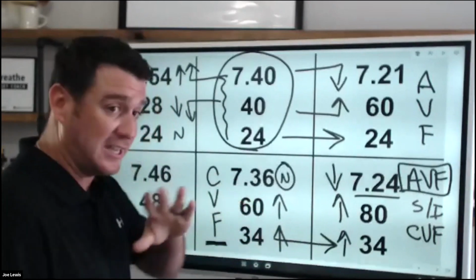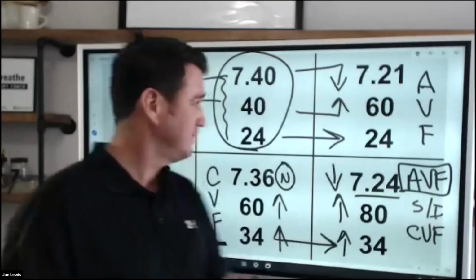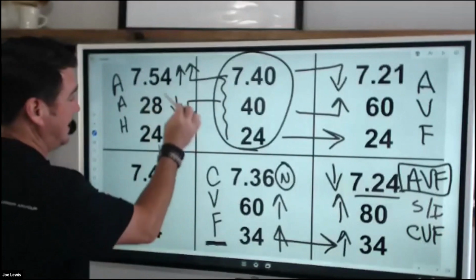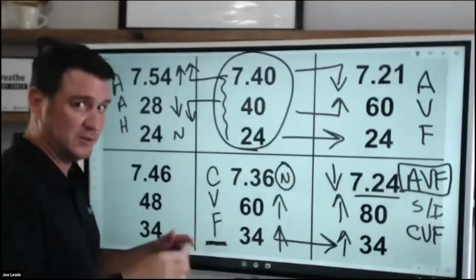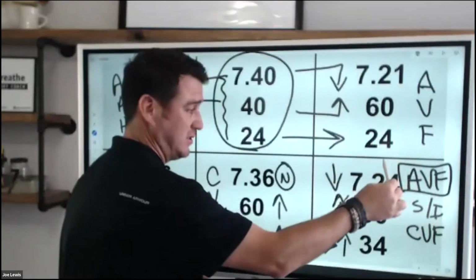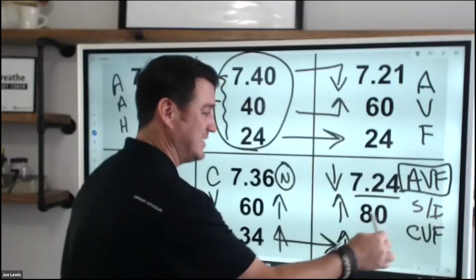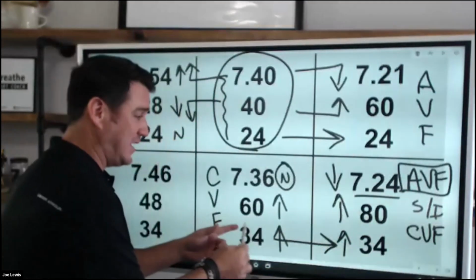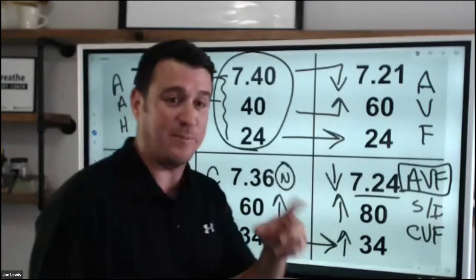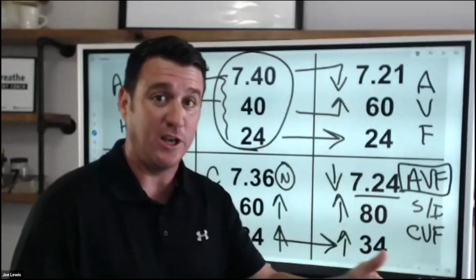If we interpret this, again, fully compensated respiratory acidosis. Watch what's about to happen. Watch this. Who's paying attention here? This uncompensated respiratory alkalosis. You see what the trend is here? Uncompensated respiratory acidosis. Partially compensated respiratory acidosis. Fully compensated respiratory acidosis.